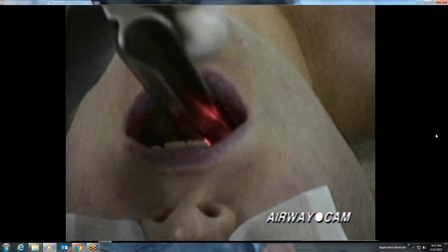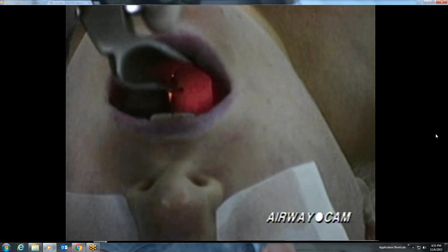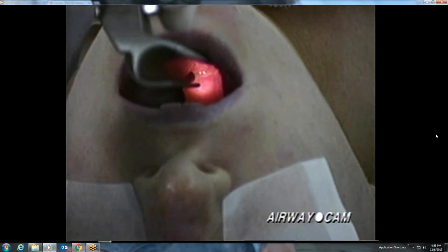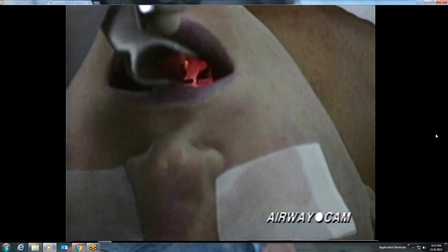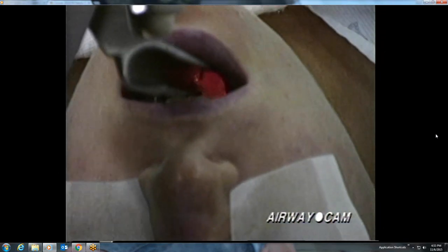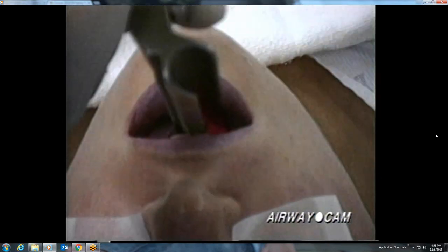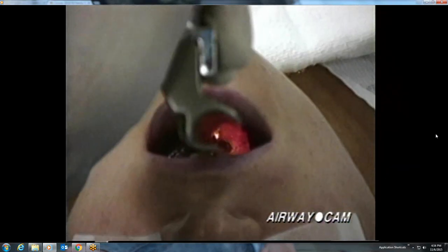The following three laryngoscopies with different blades are all on the same adolescent patient. First, let's look at laryngoscopy with the Miller blade. There's a nice view of the posterior pharynx and epiglottis, as well as the round opening into the esophagus. More anteriorly is the larynx, and the posterior cartilages and glottic opening are well seen after repeat manipulation to lift the epiglottis.